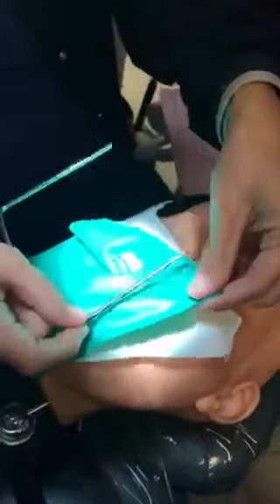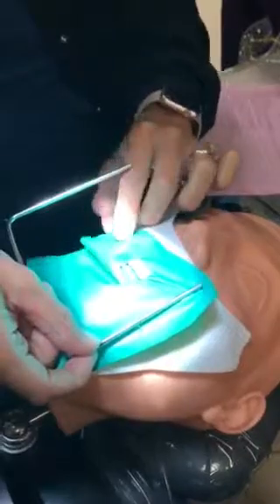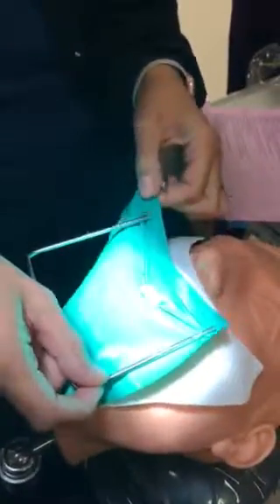Okay, pull it down so it's not on his nose. Get my frame, and again I'm going to pull it tight so that it grabs those prongs. Okay, so now my dental dam frame is on. So now what I'm going to do is the right side first. I'm going to pull over the canine, and I'm going to pull over that first premolar, and then I have it down. Now normally I would put my wedge cord, right? But instead I'm going to put a clamp.